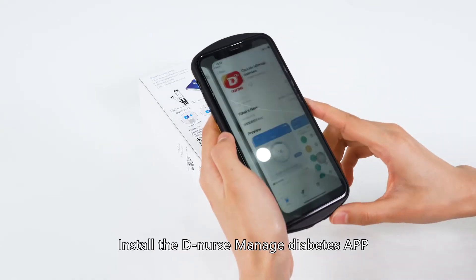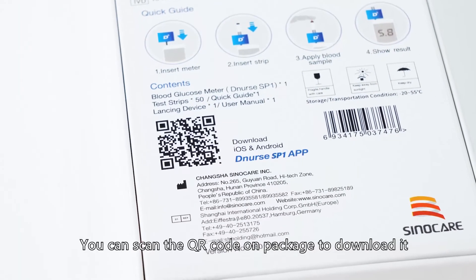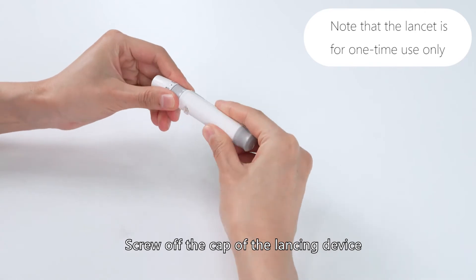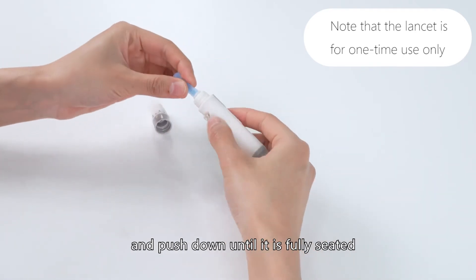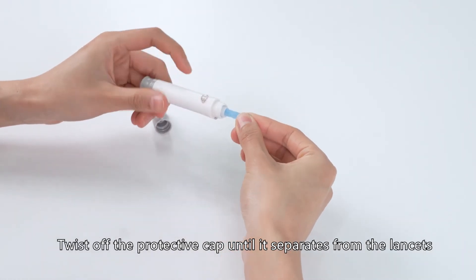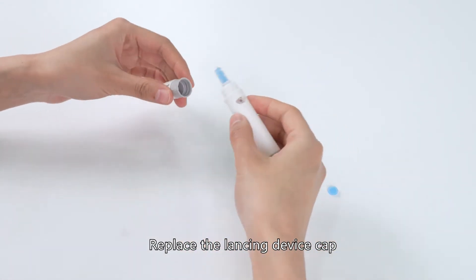Install the DNURSE Manage Diabetes app — you can scan the QR code on the package to download it. Screw off the cap of the lancing device. Insert a lancet into the lancet holder and push down until it's fully seated. Twist off the protective cap until it separates from the lancet. Replace the lancing device cap.